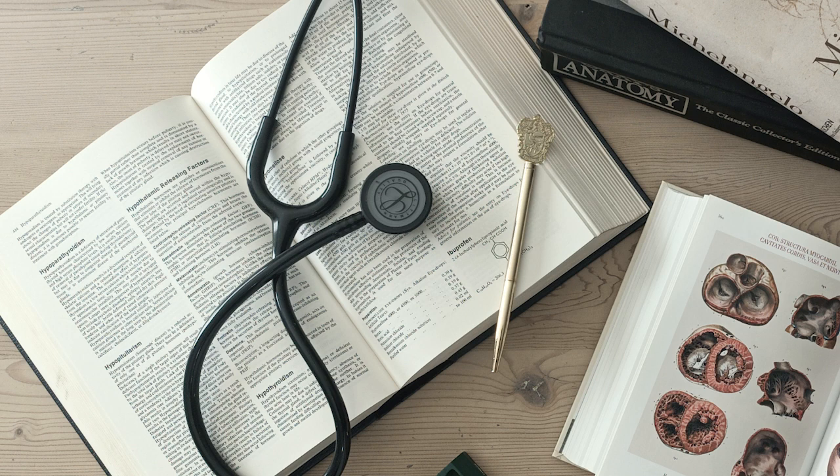Exactly. On the ECG, you'll see the abnormal P wave occur, but it is not followed by a QRS complex. This appears as a missing beat, or a pause, because the AV node simply cannot conduct the impulse. Interestingly, the next normal SA nodal P wave might also appear missing or delayed, because the atria themselves might still be somewhat refractory from that early atrial depolarization, resetting the SA node timing. Oh, okay, that makes perfect sense. The AV node is just totally unresponsive. What's the second type of APC conduction?